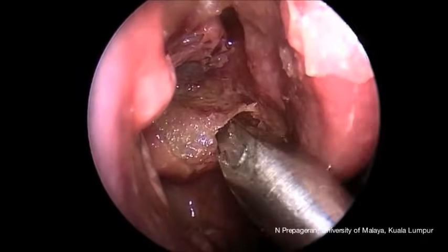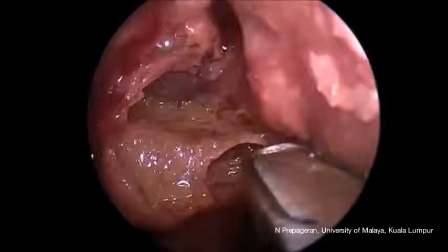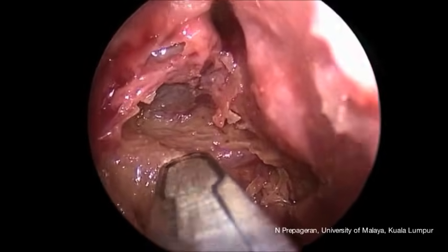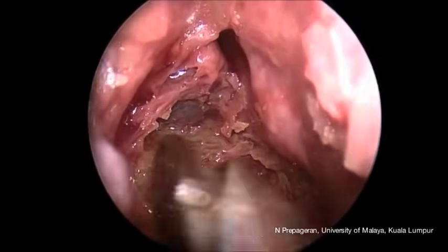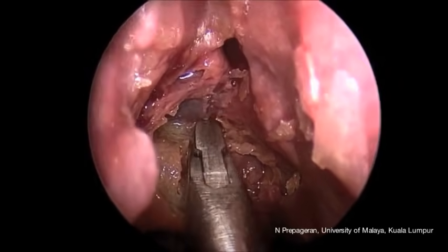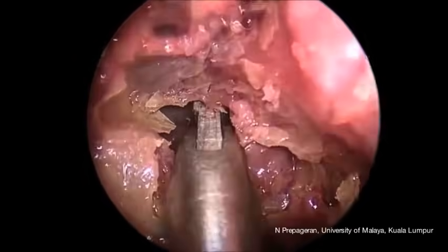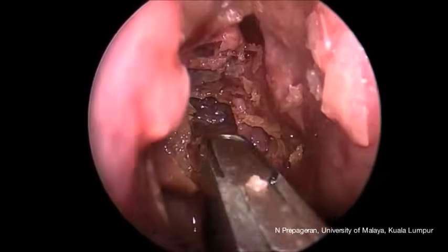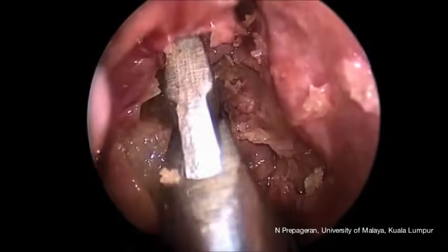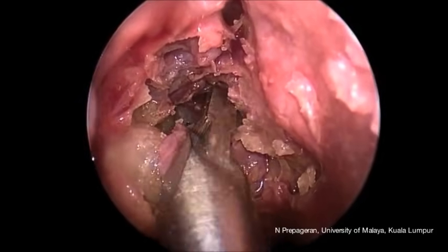In some parts the ground lamella can be quite hard. To enter the posterior ethmoids, the best place is between the junction of the vertical and horizontal portions. Make sure there's an air cell at the back — in some areas it can be quite tough. Once we know there's an air cell, excise the ground lamella to expose the posterior ethmoids. The posterior ethmoids usually have larger air cells, sometimes a single air cell. You can do this with powered instruments or cutting forceps. We are now removing the ground lamella completely to visualize the entire posterior ethmoids.